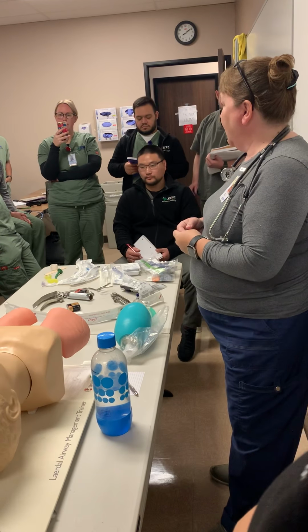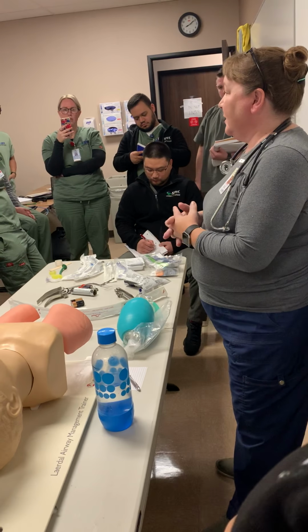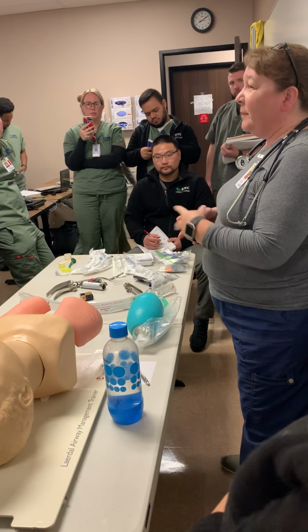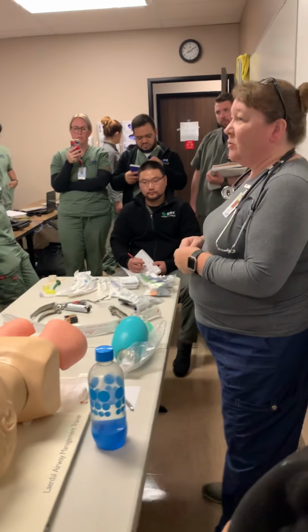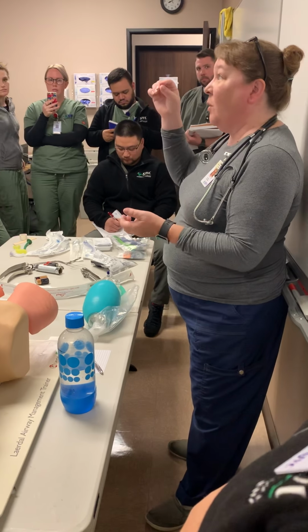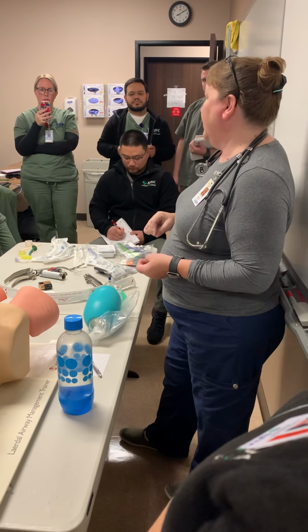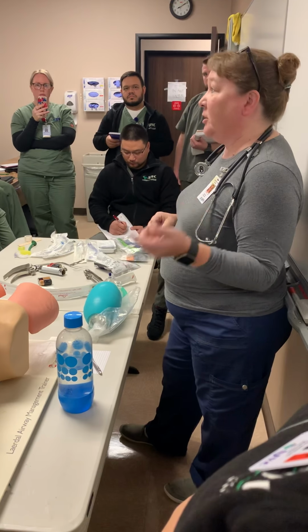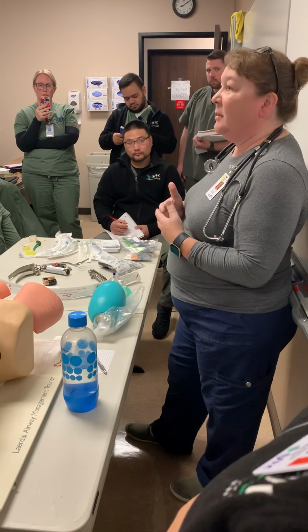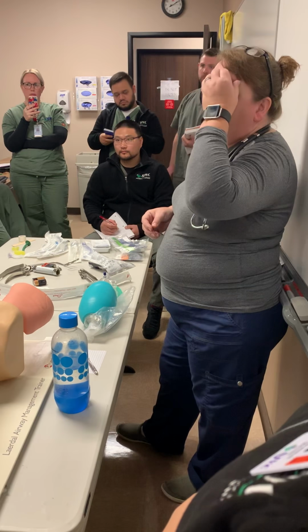Any questions on that? What could be some hazards or complications that arise? Infection. Yeah, it would be more related to VAP, ventilator-associated pneumonia. Airway spasms? Yeah, you could have airway spasms, but that would be more while we're trying to put the tube in. Then you might have a problem getting the tube in. Bleeding? Oh yeah, for sure. You get somebody who's just hell-bent on getting a tube in and they can't, and you cause all kinds of trauma, which would also lead to swelling. Yeah, you can have vocal cord trauma.